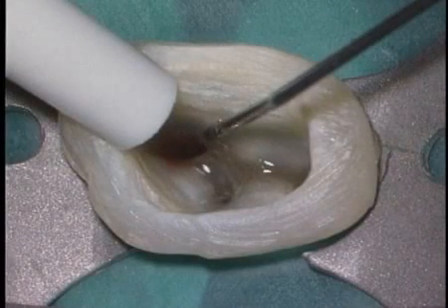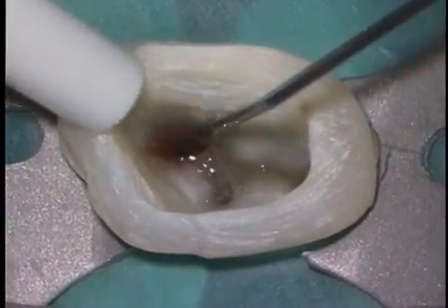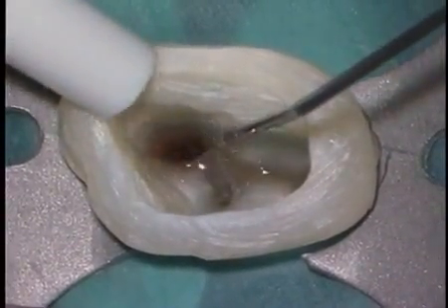Apical 1/3 perforations pose formidable treatment challenges. The radiopaque solution roadmaps the perforation. These defects oftentimes require surgery to absolutely correct them, but in some instances we can go back in non-surgically and accomplish the goals. Clinically, upon re-entry, these cases are very vascular, so we'll flush with sodium hypochlorite to free up and liberate a lot of the byproducts from the root canal space.